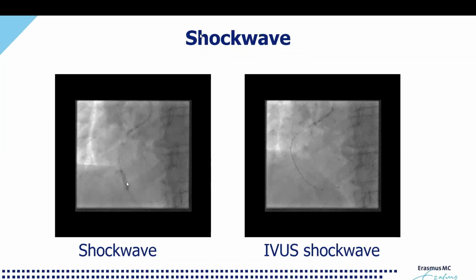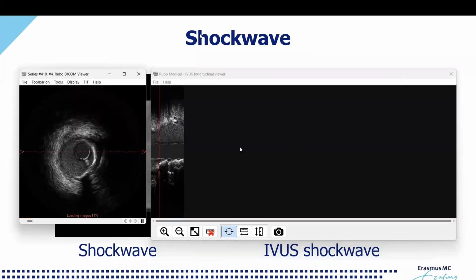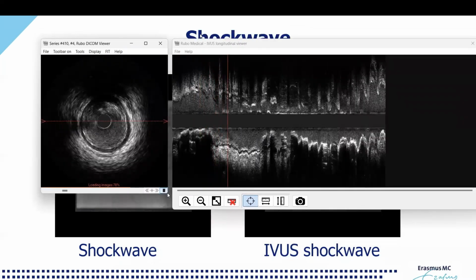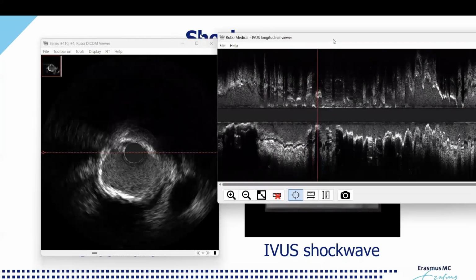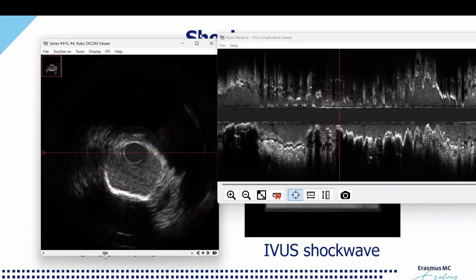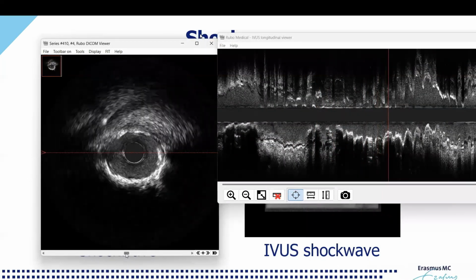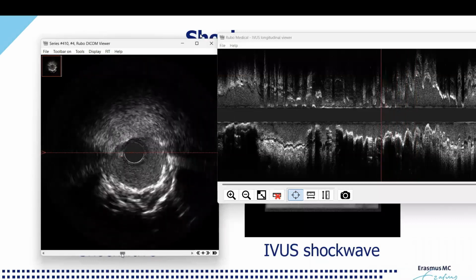The shock wave was done on a couple of spots. I will just, for an example, indicate the shock wave I put in here, but also they were in the stent. Let's see. And normally you would say, well, use a shockwave before the stent, but we didn't have everything. So at least let's try to crack the calcium behind the stent to get at least the resistance there, so that maybe we can do some post dilatation. And actually it worked a bit, you see.